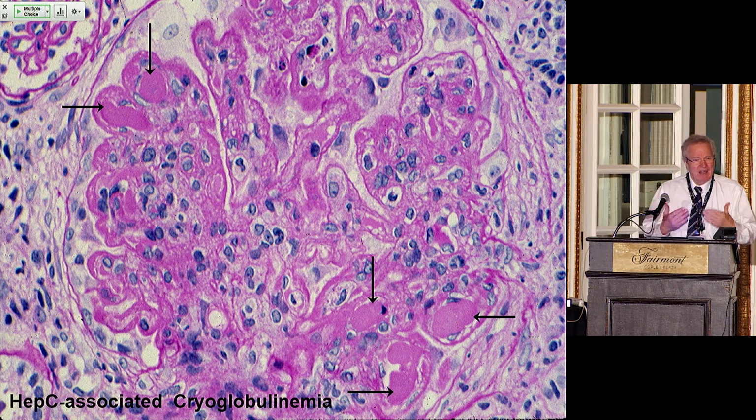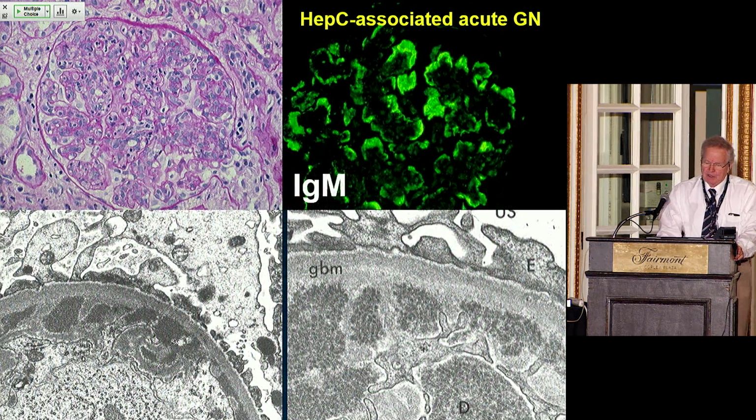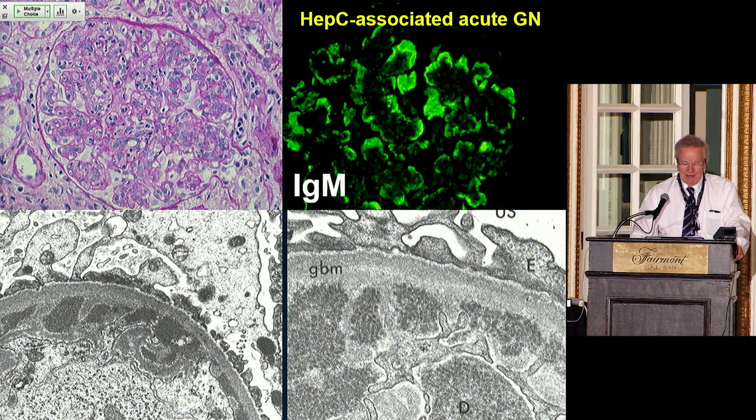So the etiology is relevant. The mechanism that results in a membranoproliferative pattern is relevant for you to discover, and not the pattern of injury. So hepatitis C, characterized by subendothelial deposits. Here again, there are some substructures.